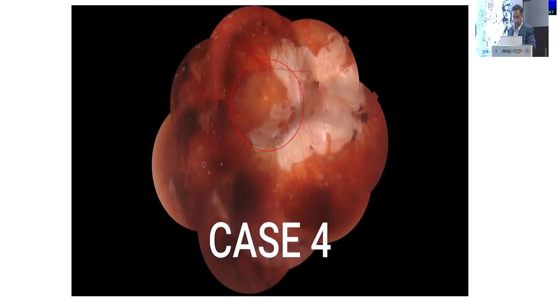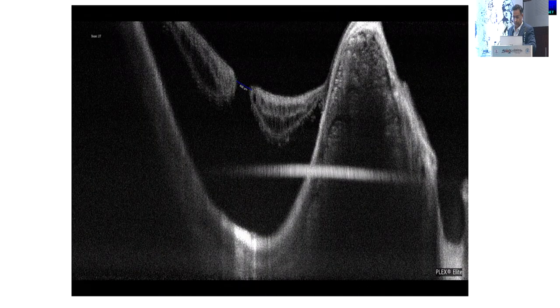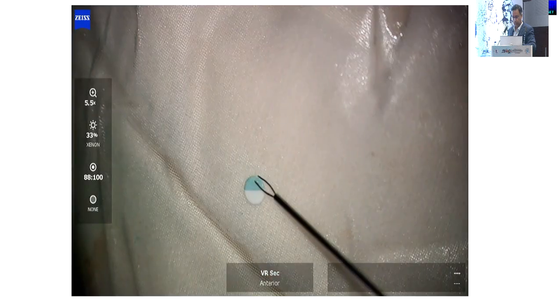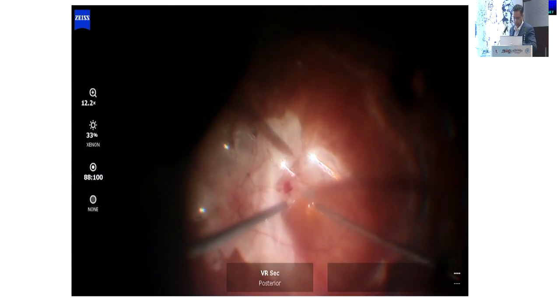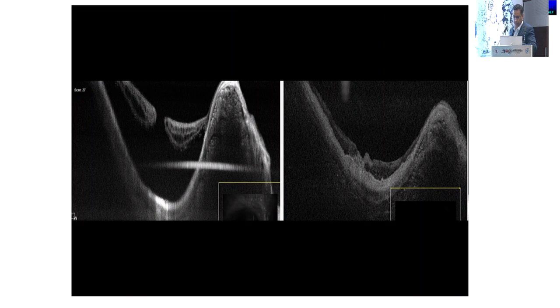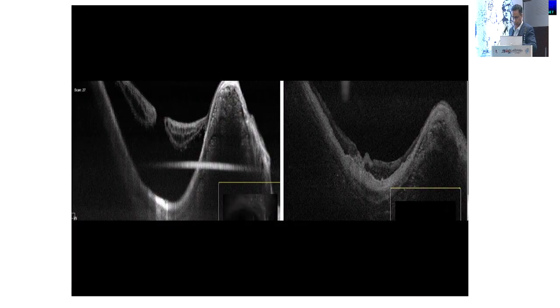This was a very high myope with a posterior pole retinal detachment and a macular hole. In this case, we slid in the HAM after fluid air exchange. In such cases, we take the graft size to be twice the MLD. See how scary the pre-op OCT was and how nicely the retina is settled with a HAM graft.